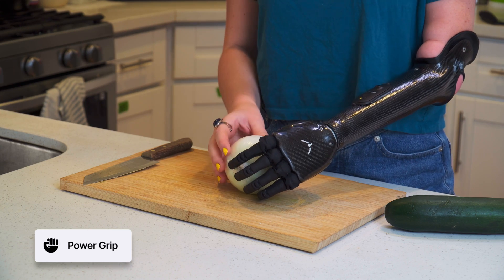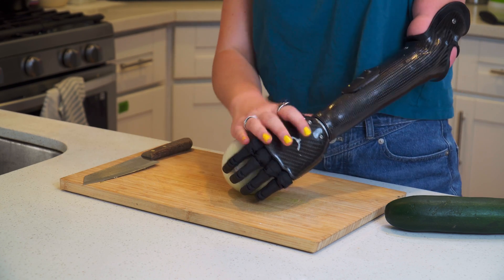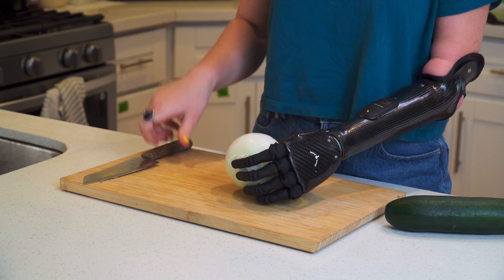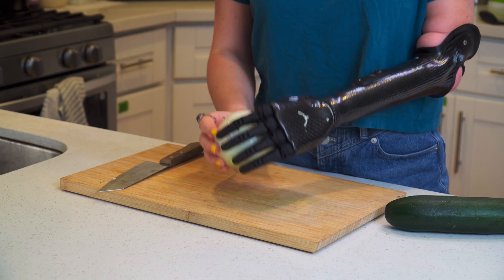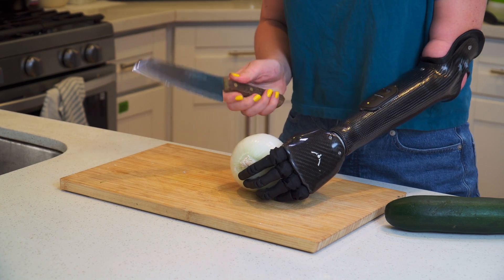For something of this shape I want to get a good hold around the whole food item and also press it down against the cutting board. I don't want it rolling anywhere, especially if I'm going to have the knife really close. So to start, power grip — I'm going to press down especially for that first cut.